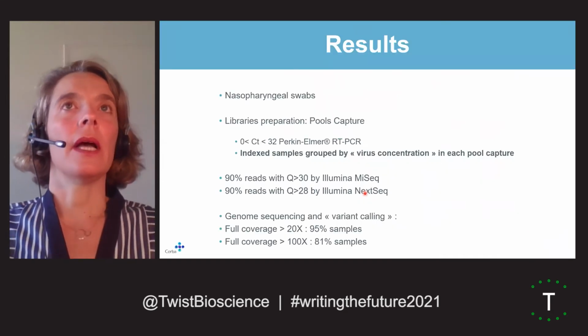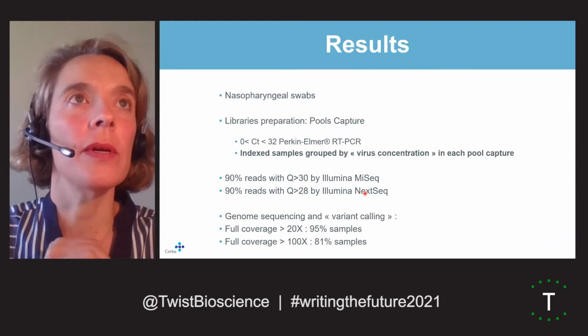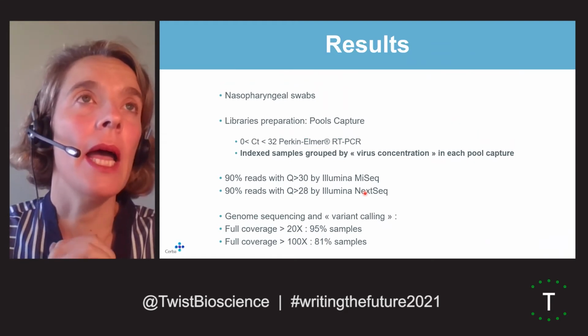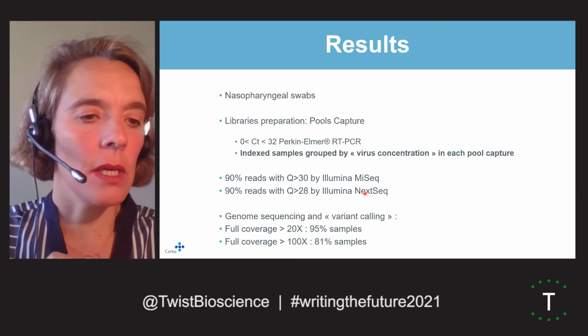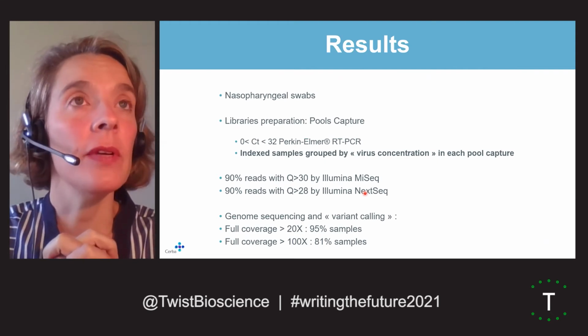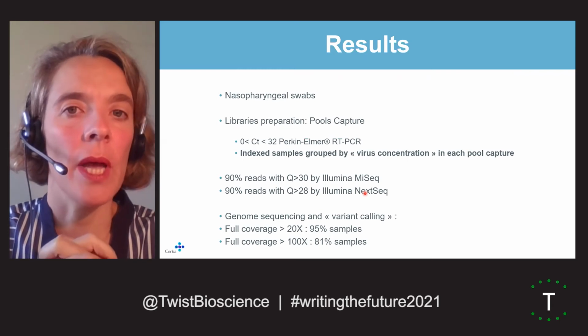Here are presented our bulk results from direct next-generation sequencing of human nasopharyngeal swabs from COVID-19 positive patients we had in our lab.